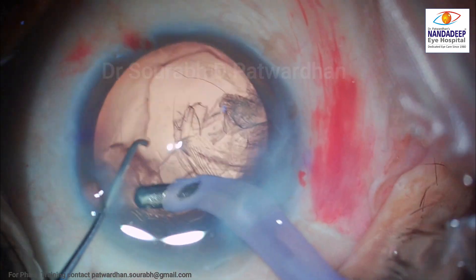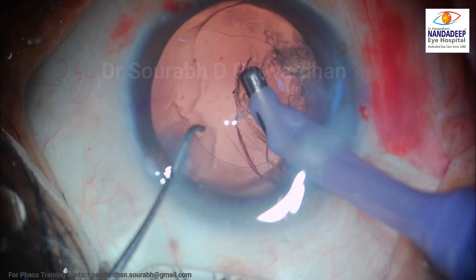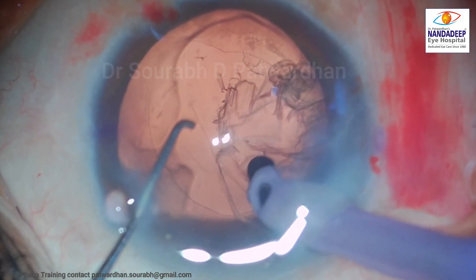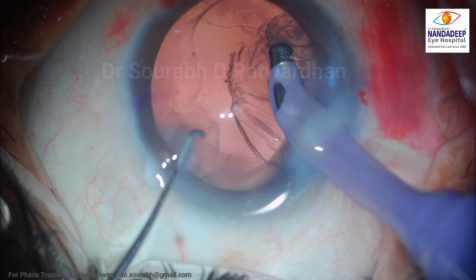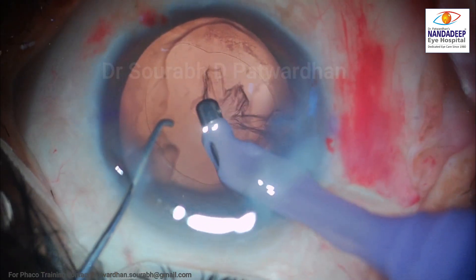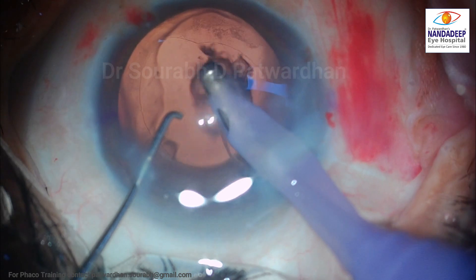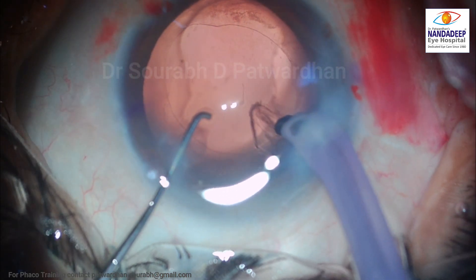And that's why I am a bit more observant here. You can see those folds in the posterior capsule showing the redundancy of the capsule, and those small debris behind the capsule. In such cases, I have to be extra careful because the IA probe might catch the posterior capsule and tear it if I am not observant.